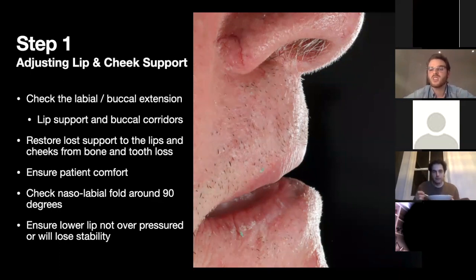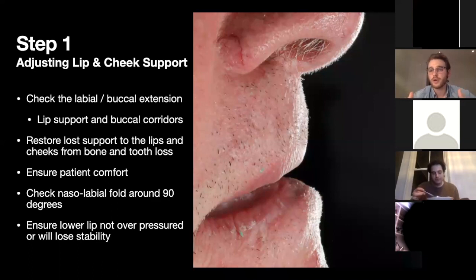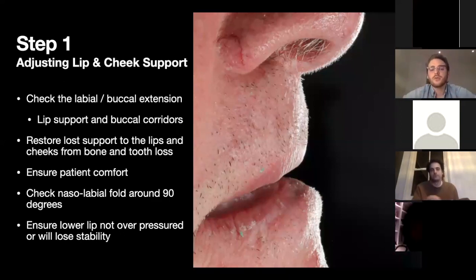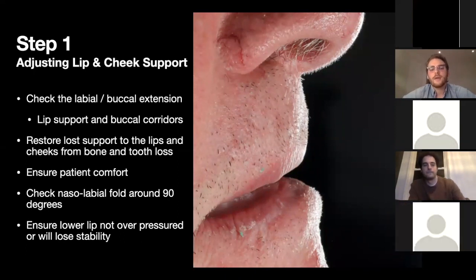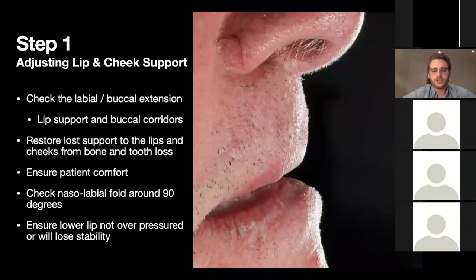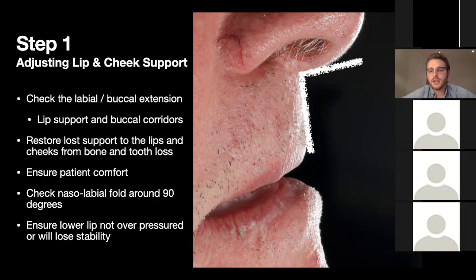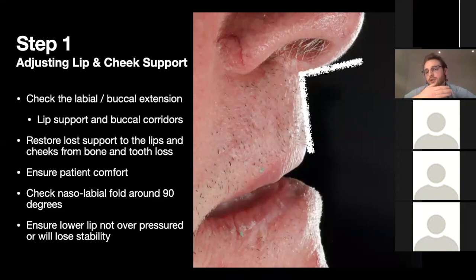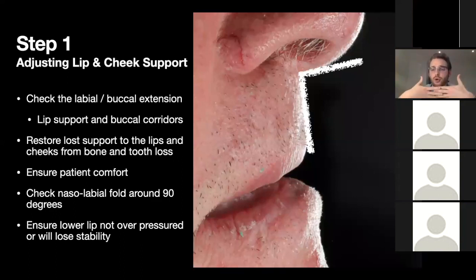It's important to remember we're not just replacing the teeth — we're also replacing the bone and gum tissue that's been lost. When all the teeth come out, the bone shrinks inward, which is why someone without dentures has a collapsed-in, collapsed-upward face. We want to replace that tissue too. Make sure it's comfortable, not pressing out too much, and check the nasolabial fold — you want around 90 degrees for a nice balanced position. Also check the lower lip isn't being pushed too far forward, which would place the teeth outside the neutral zone and cause the denture to dislodge.